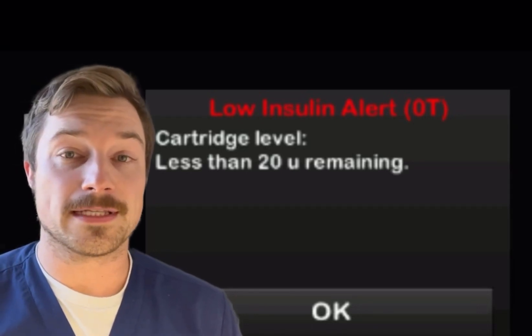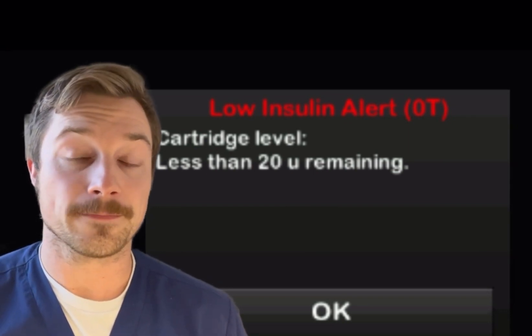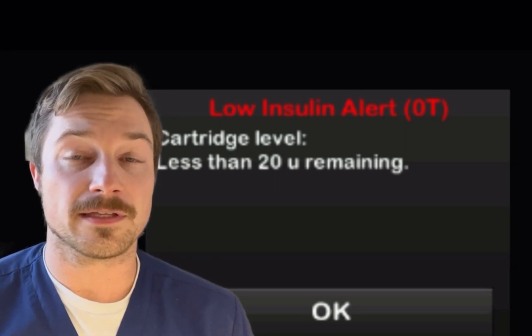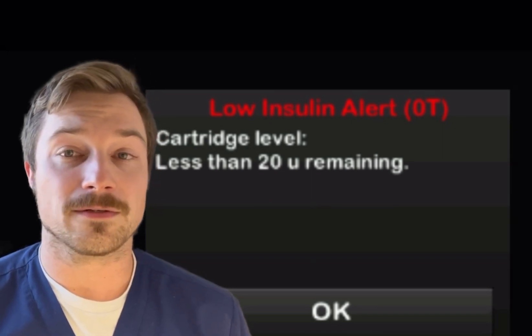When you receive the low insulin alert on your insulin pump, you will notice a notification on your pump that says low insulin alert, zero T. You can hit OK once you've seen this to clear the alarm. This is simply the alarm that was programmed into your pump to let you know that you have low insulin in your cartridge.